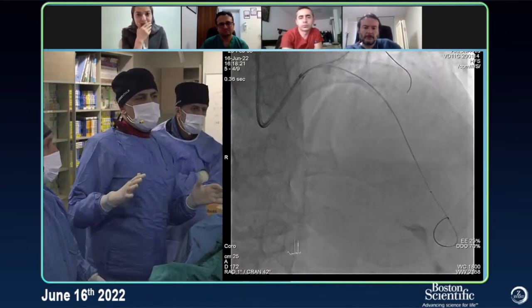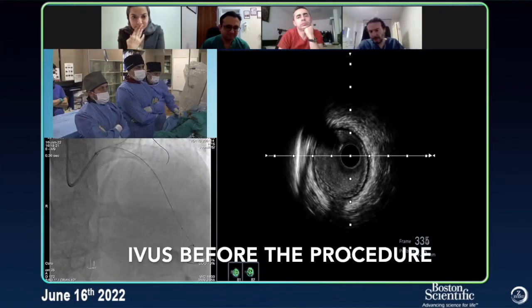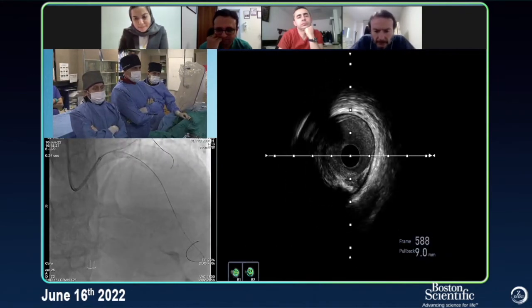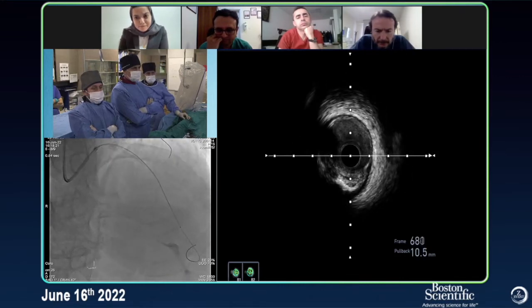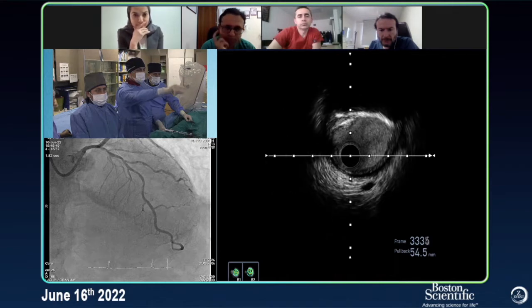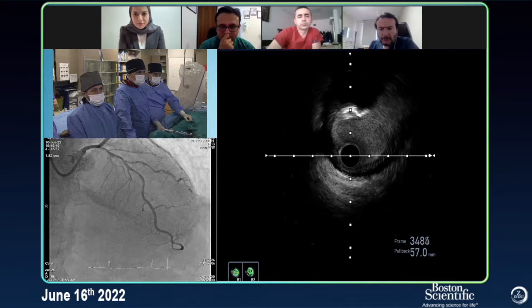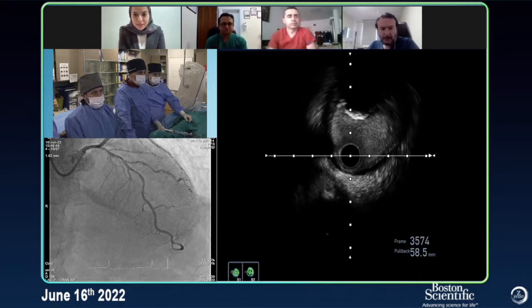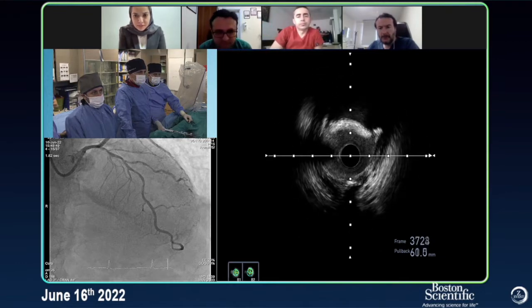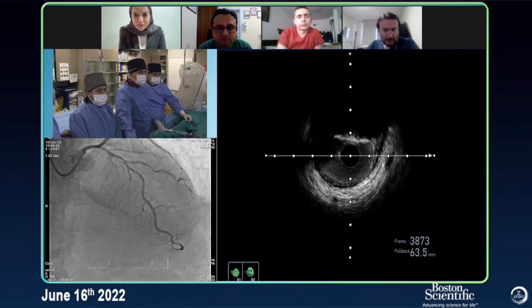Then we did IVUS before rotablation to show you. Let's see the IVUS first — this is the distal healthy part, around 2 to 3.1 mm. Now we are coming to the diseased part: a very calcified lesion that we can't see much beyond the calcification. A great shadow — a classic example of typical calcification on IVUS. And I'm assuming you went all the way to the left main, which we're probably about to see in a second.